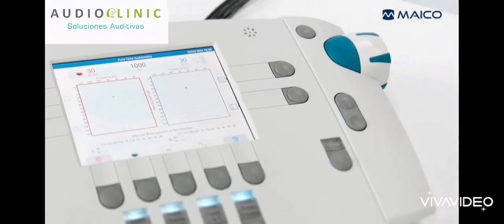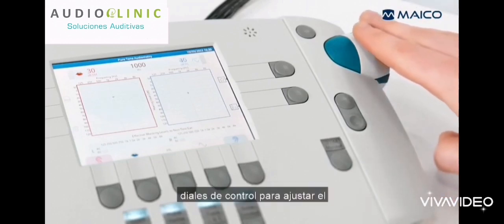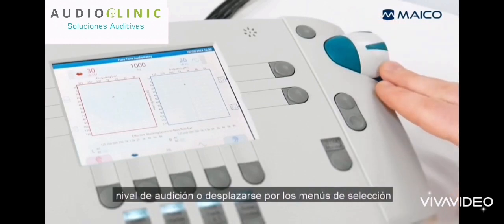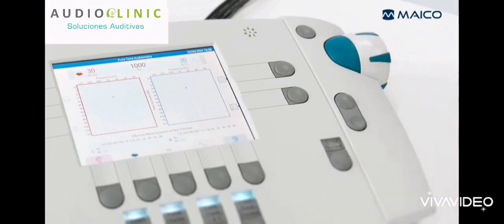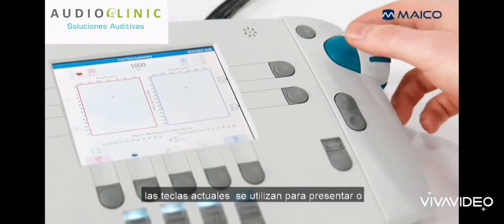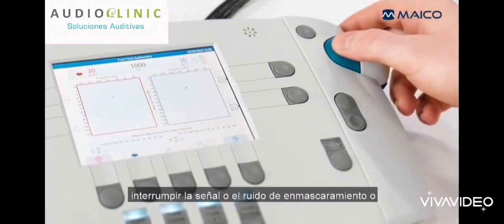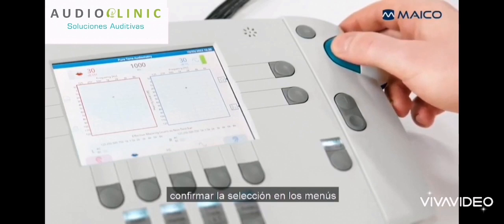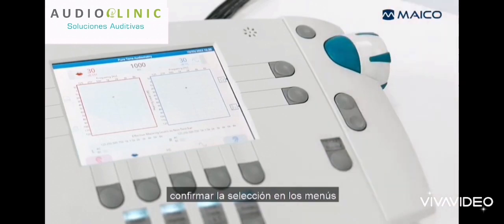The side function keys include the control dials to adjust the hearing level or scroll through selection menus. The present keys are used to present or interrupt the signal or masking noise, or confirm a selection in menus.